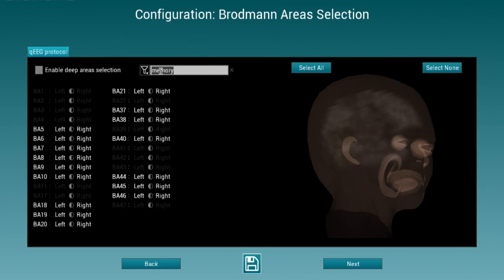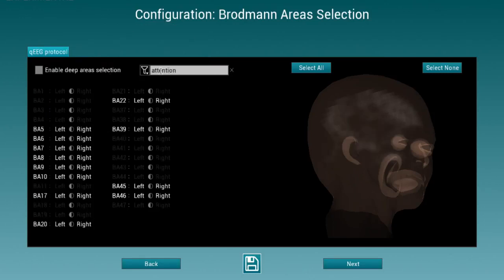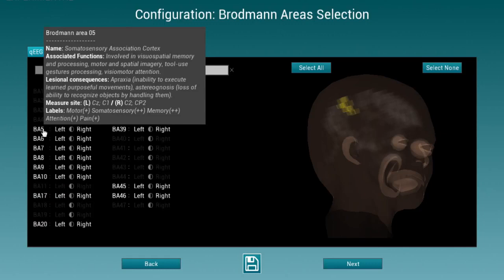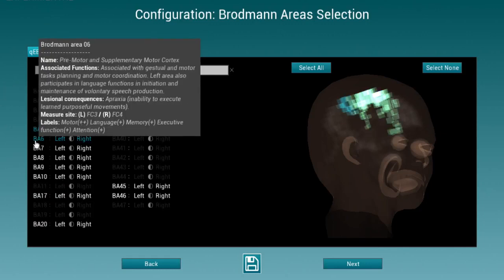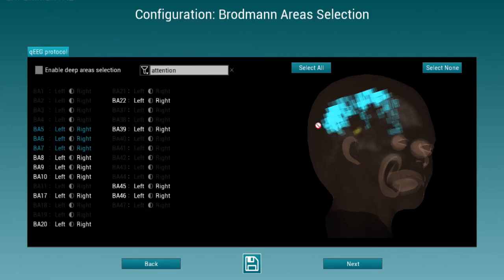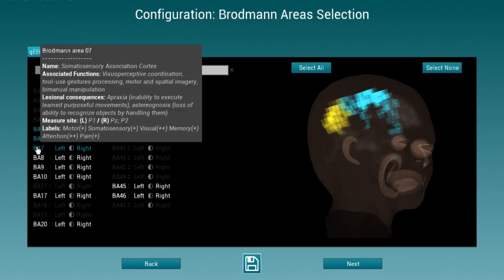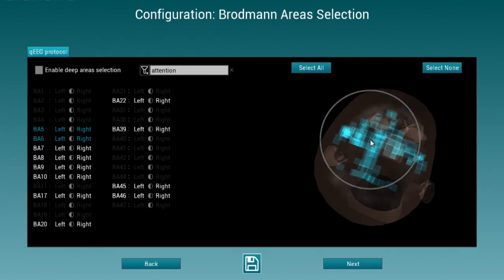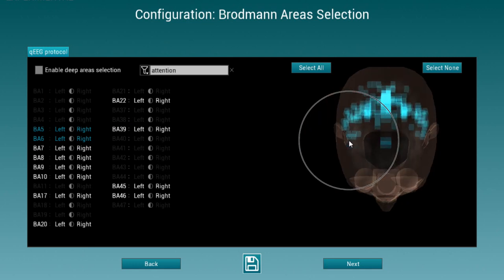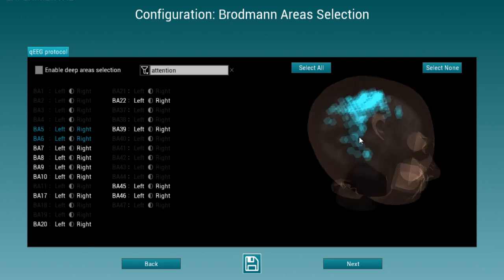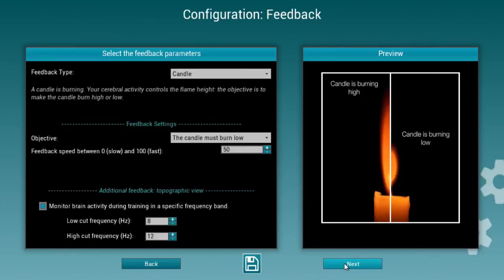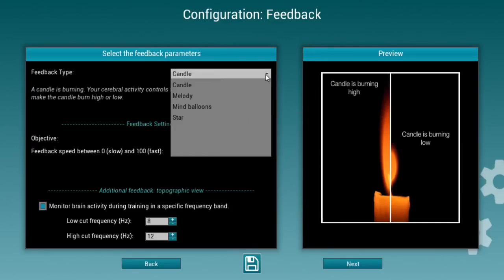You can select the Brodmann areas you're interested in and see the results in three dimensions on the right-hand side. Once you are happy with the Brodmann areas you'd like to reinforce, just press Next and decide on the feedback you would like to use. There are a few variable feedbacks available and more will be added soon.